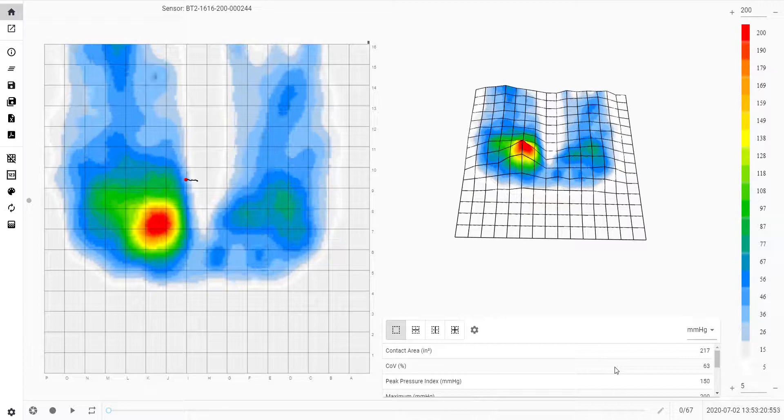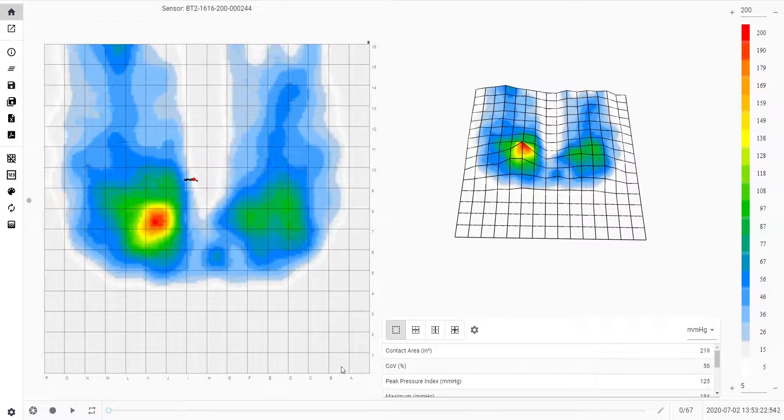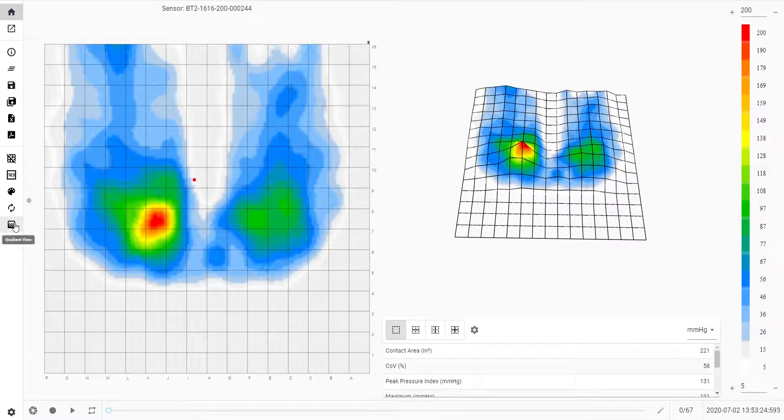If you are unsure of any icon, just hover over it and it will tell you what the icon means.